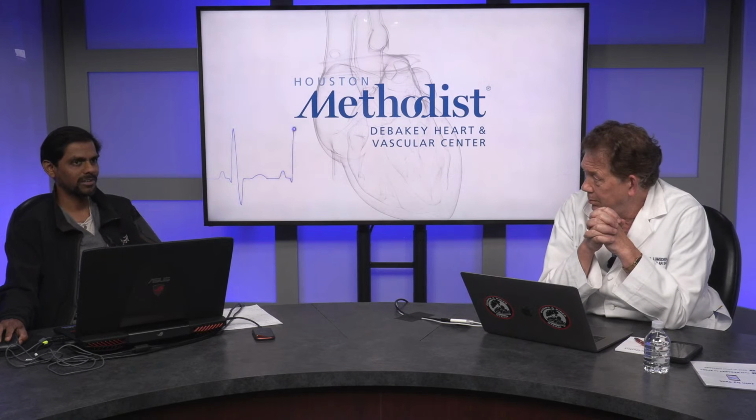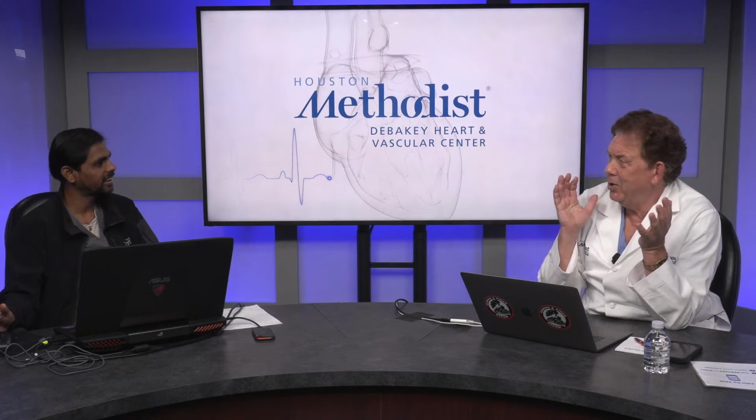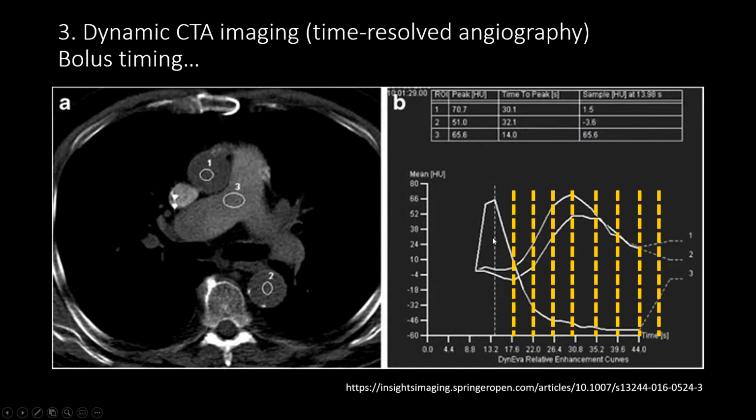And I also noticed one of the questions here is, okay, now instead of doing one scan, we are getting like 6 scans. How much radiation? You're irradiating the heck out of the patient, Ponraj. So, this is where I go back to the latest generation CT scanners, where we really can customize. It's not like a cookie cutter approach where if you get a CTA chest, abdomen, pelvis, every scan has to be done at 120 kV or 100 kV.